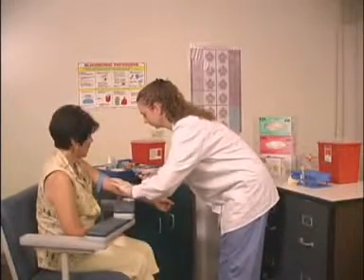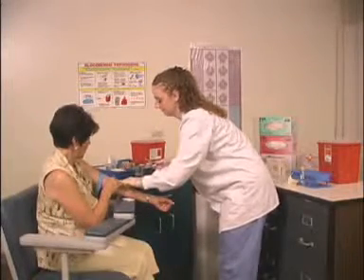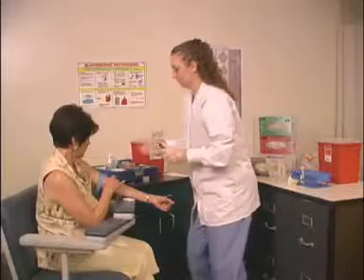Immediately apply pressure to the site with your free hand, while simultaneously activating the needle safety device with the other, to prevent the chance of a needle stick.